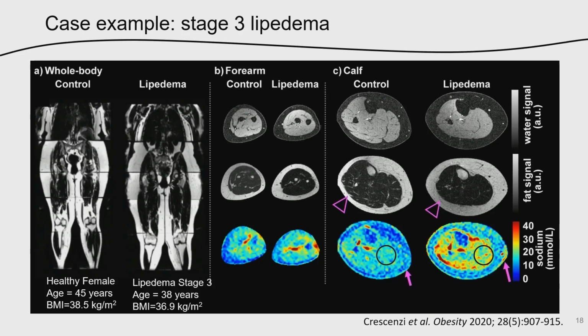And that range there is from 0 to 40 millimole per liter of tissue sodium. It's an average sodium across the intra- and extracellular space. And we think this is in the physiologic range that we see across the lifespan in just healthy people.